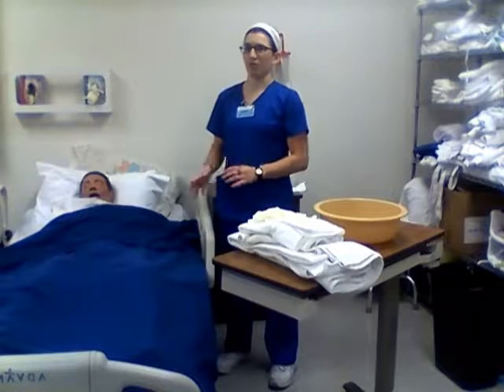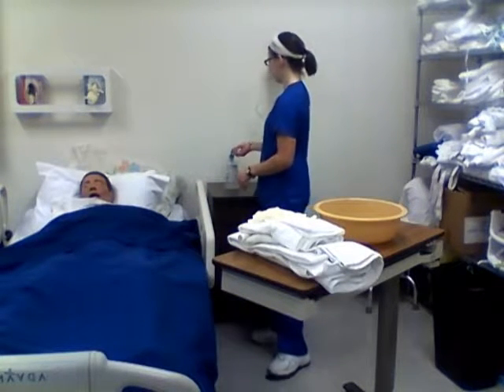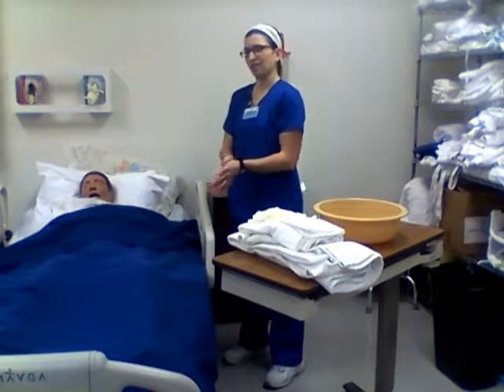I'm going to be performing how to put in a Foley catheter today. So when I walk into the room, I'm going to perform hand hygiene, and I'm going to ask 2 identifiers to the patient. So I'm going to ask the name and date of birth.